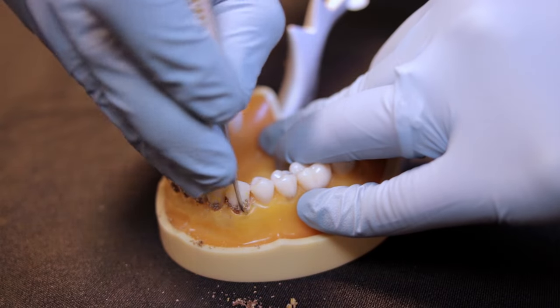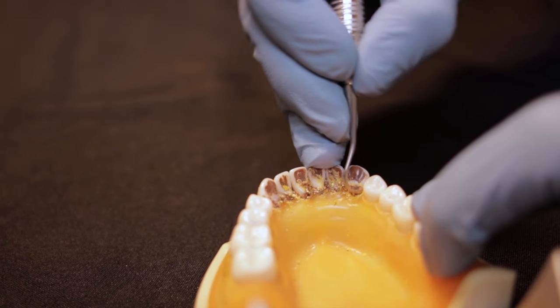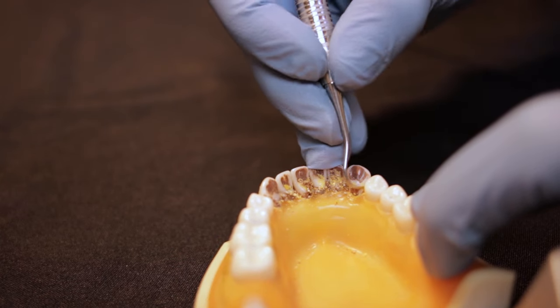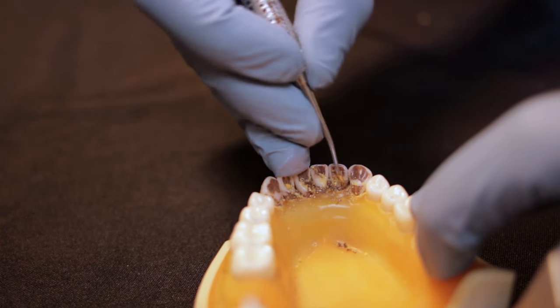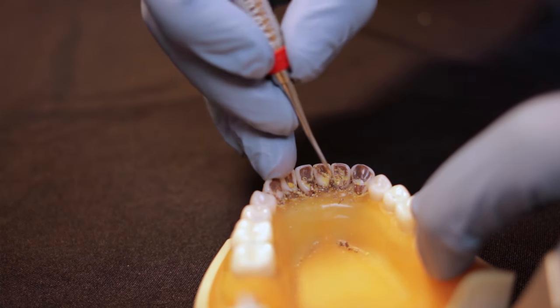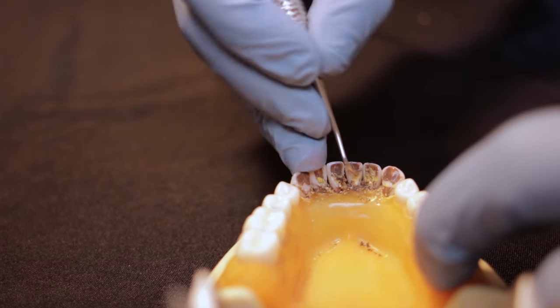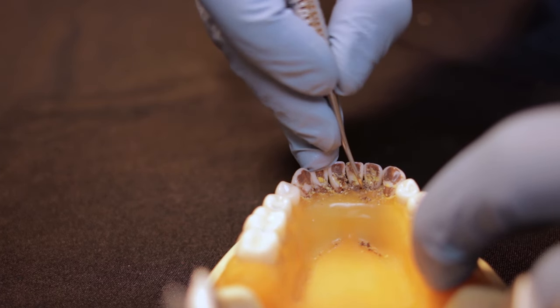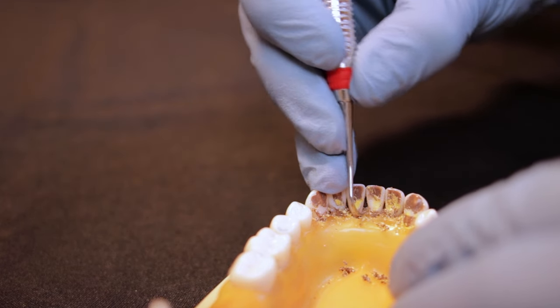Now that we've done all the surfaces away with the sickle scaler, we're going to switch and do the surfaces towards us. Rock on your fulcrum and double check that your handle is tipped up towards the maxilla as much as you can — that way you'll be able to get right underneath the contact. Make sure you're using the very last one to two millimeters of the instrument; if you're on the middle of the instrument it will be too thick to reach the calculus underneath.